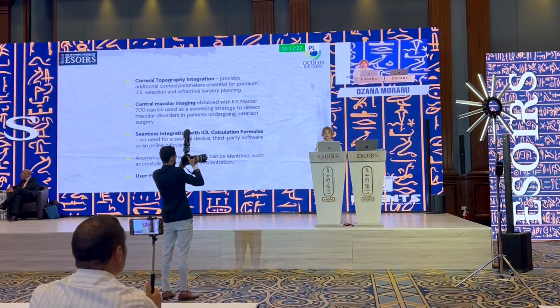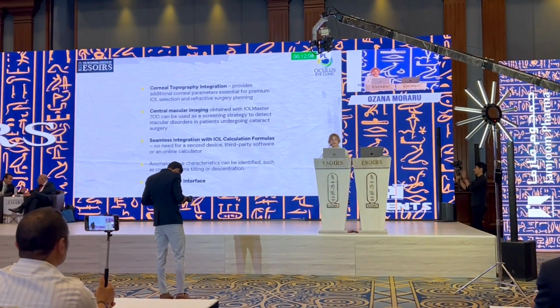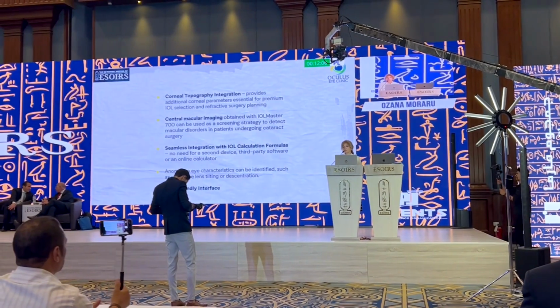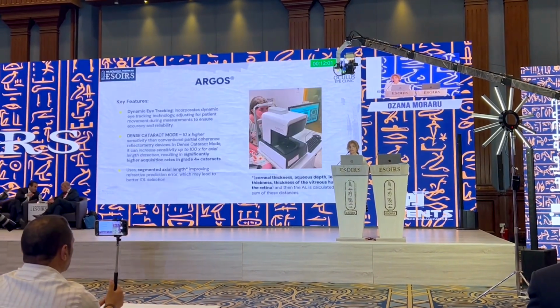It has integration of corneal topography, central macular imaging. This is very important because you can use it as a screening strategy to detect macular disorders in patients undergoing cataract surgery, and it happened this several times to me. It has an integration with IOL calculation formulas, and it is quite a user-friendly interface.